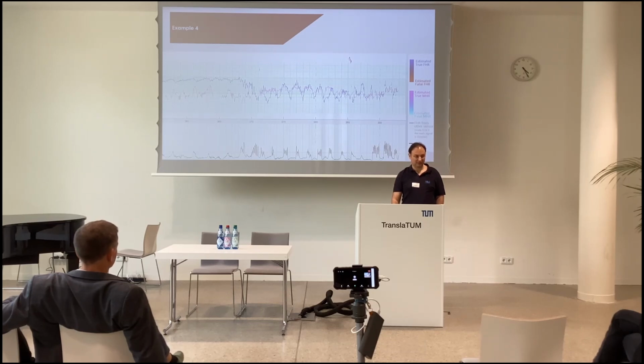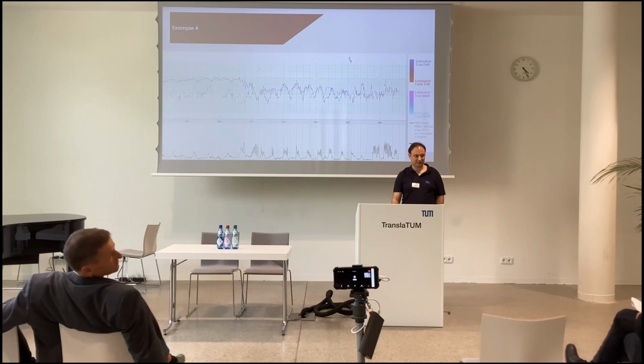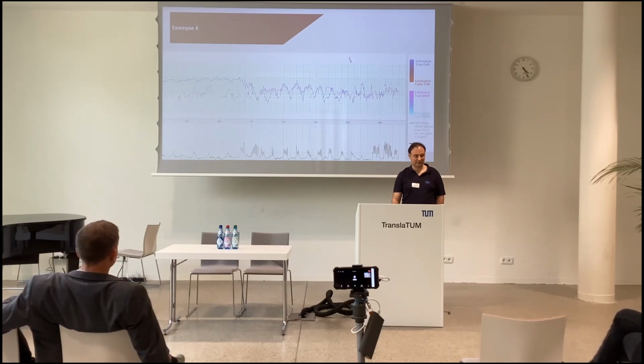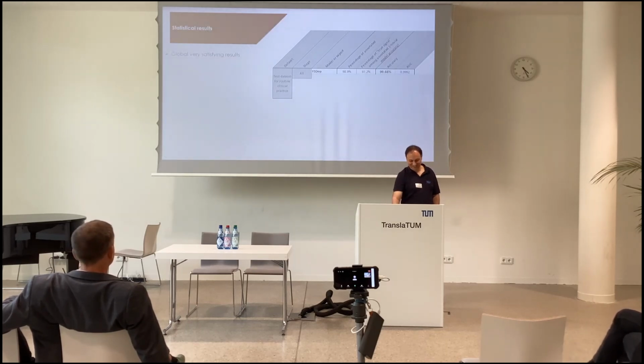If this woman is in active second stage, it's almost inconceivable that you're going to end up with those accelerations in a baby while mom is pushing. It just doesn't make physiologic sense. That's what makes me think it doesn't fit what I would expect of a normal real life situation.